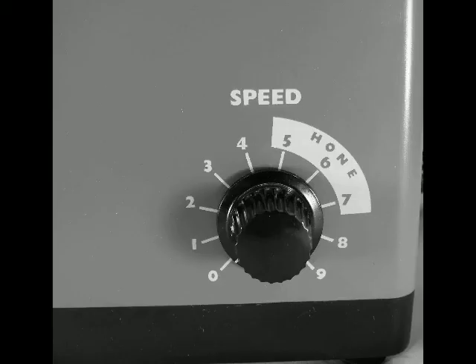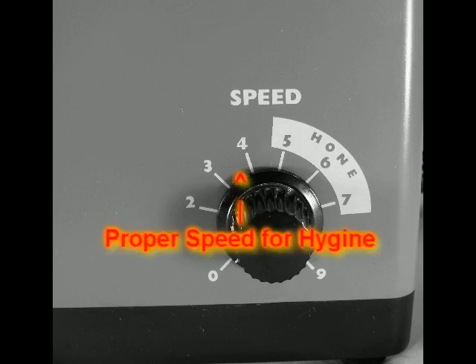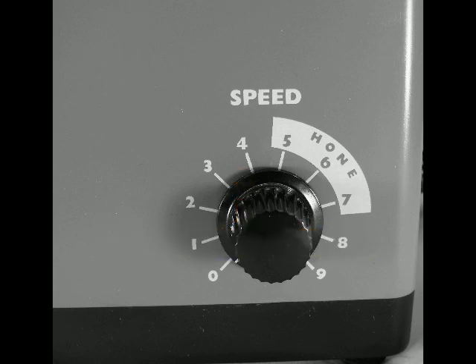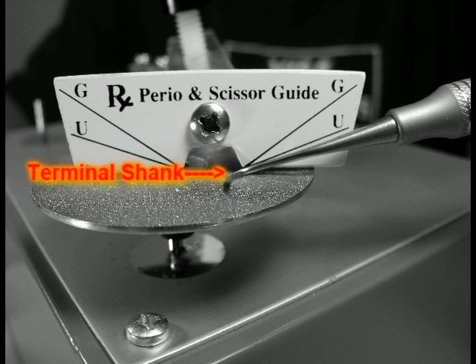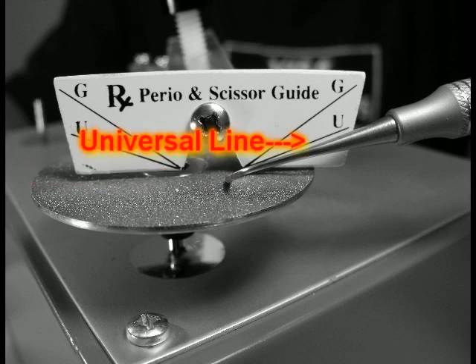Next, we want to make sure that the disc hone control is set to disc, and that the speed control is set to approximately somewhere between 3 and 4, so that we get the optimal speed for sharpening our instruments. The first instrument that we will be demonstrating is the universal scaler. You will notice that the terminal shank of the instrument is lined up with the universal line, the line marked U on the Perio scissors guide.